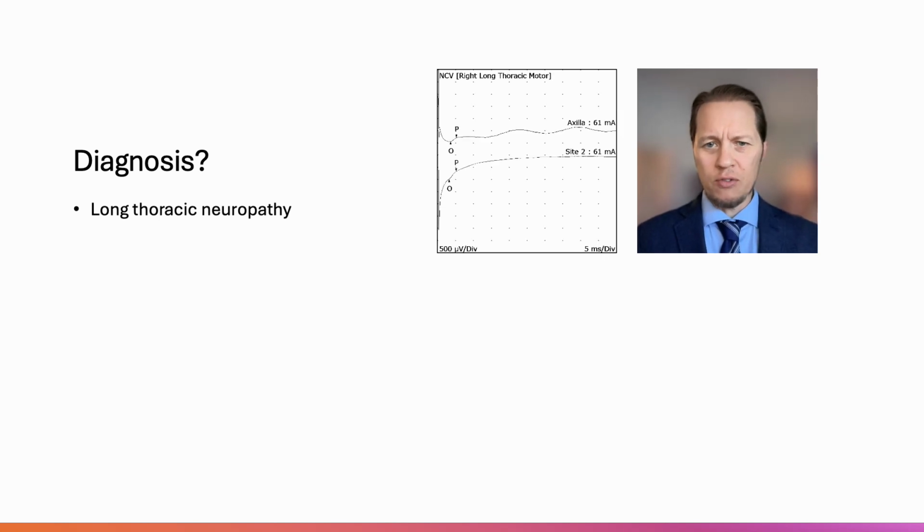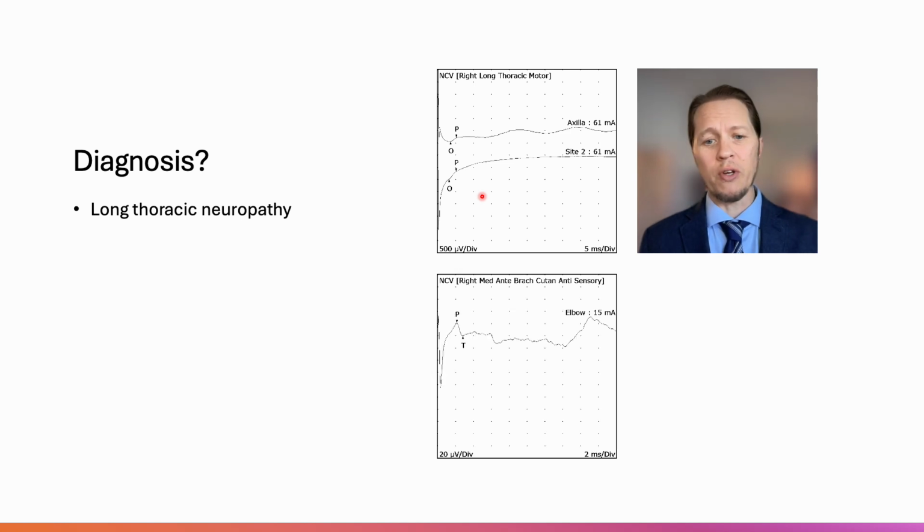Now, if you wanted to see the waveforms here, that was really questionable. This first one here, you could argue that the ground was coming off, which it likely was. Once we got it back on, we got a much more stable baseline. Had to decrease the microvolts per division down to 500 to find it. But there is a clear break right there, so that is real, but it is tiny. It's like 0.1 to 0.3.